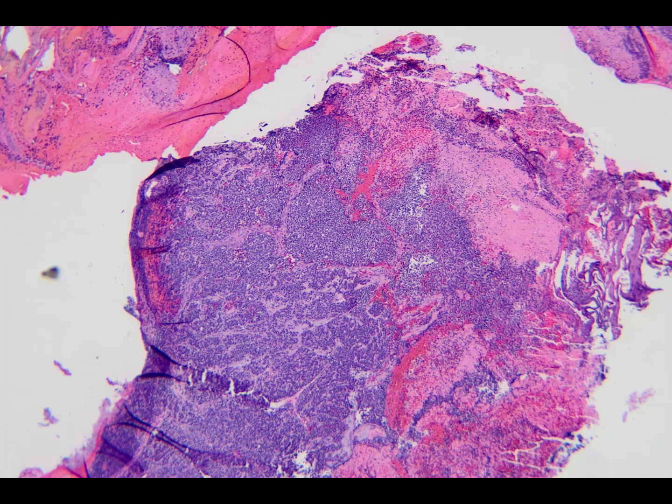Now let's look at the frozen sections for another important clue. The frozen sections show cohesive nests of malignant blue cells that have a circumscribed border from the surrounding brain tissue. Such a circumscribed border is an important clue that further supports this as a metastatic tumor. Infiltrating gliomas will characteristically blend into the brain without evidence of a circumscribed border. We made a diagnosis of a metastatic small cell carcinoma on the frozen sections.